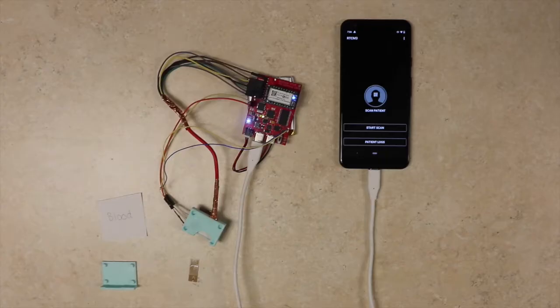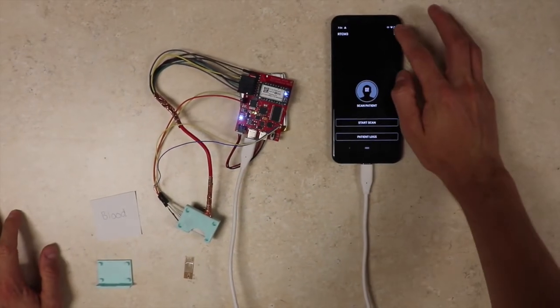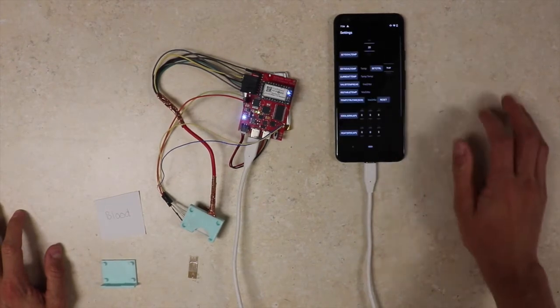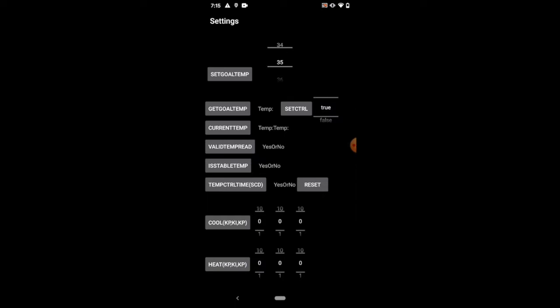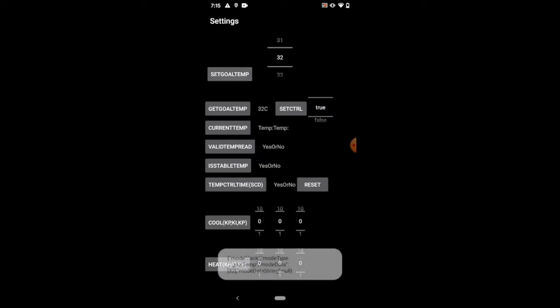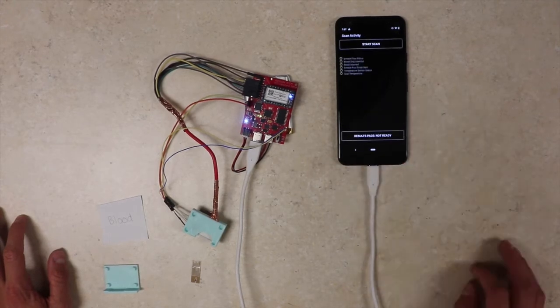We're going to take you through a demo scan of our system. We're currently in the initial state of our app, but we'll take you to our developer options where we can change the variables of the microcontroller. Here, we're changing the goal temperature, and we're setting this to 32 degrees Celsius. Here's our acknowledgement back.